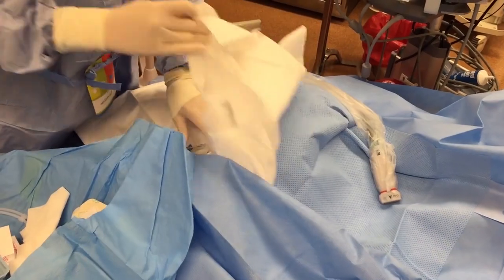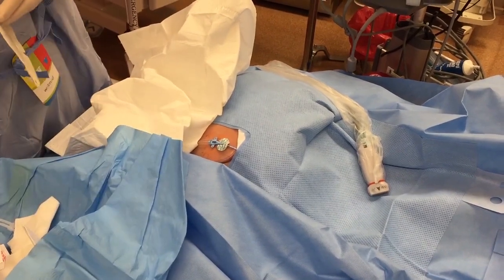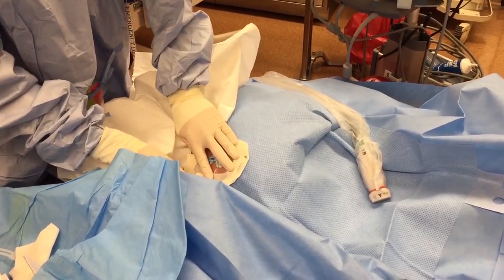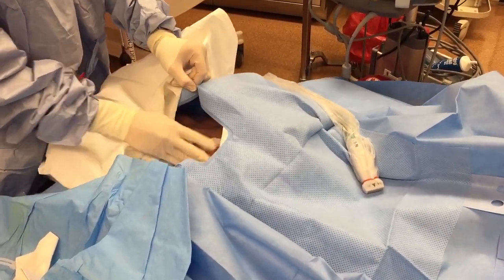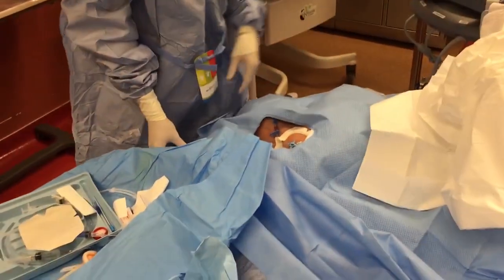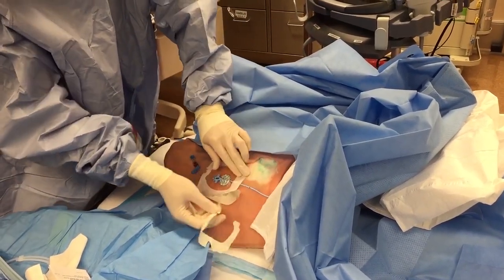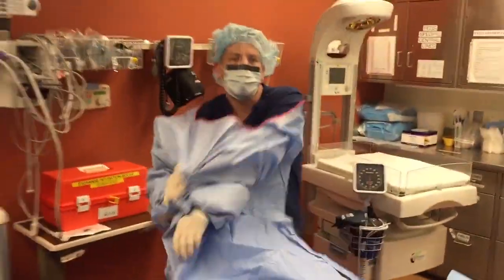At this point I like to hold the line and the biopatch, move this drape to give a little more space, and actually apply my Tegaderm. If the peds drape is still in the way you might have to take that off, but I prefer to have this line closed off before I de-drape, because that's going to keep you from ripping your line out. Peel off the side stuff, and you can mark this in the computer as a full sterile line. That's it.